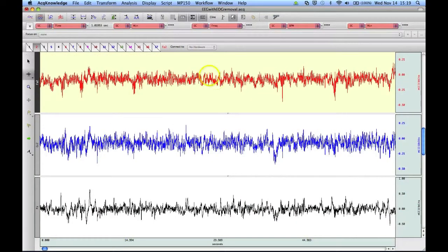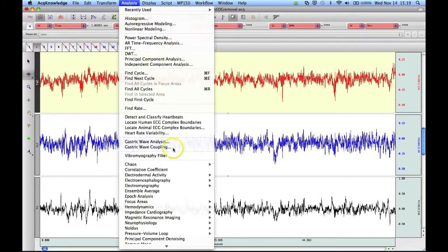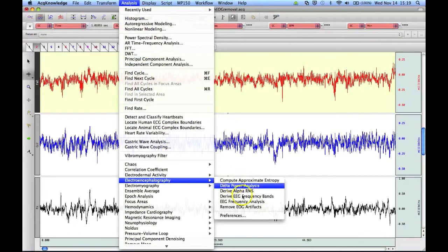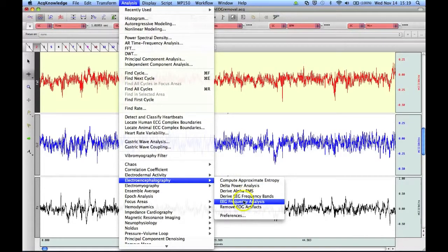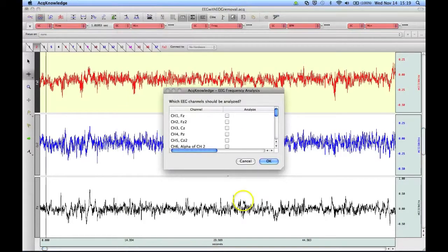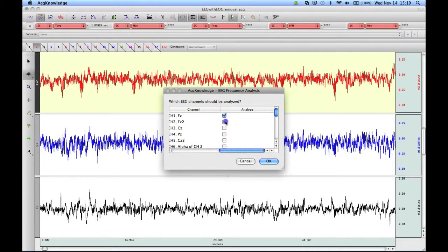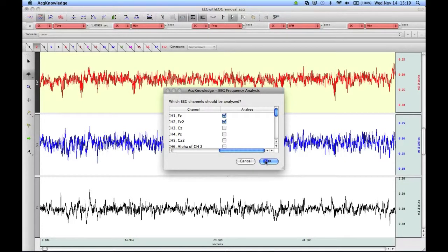Finally, let's take a look at the EEG Frequency Analysis routine. Again, we select it from the list and choose the channels we're interested in. We click on OK to analyze both of these EEG channels at the same time.